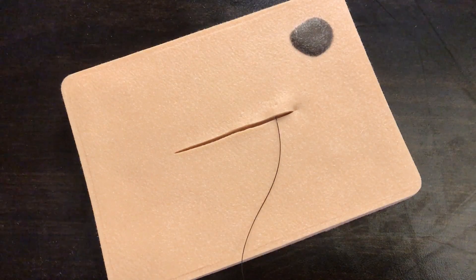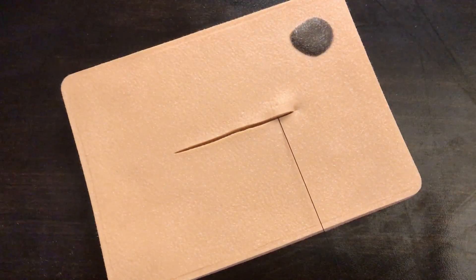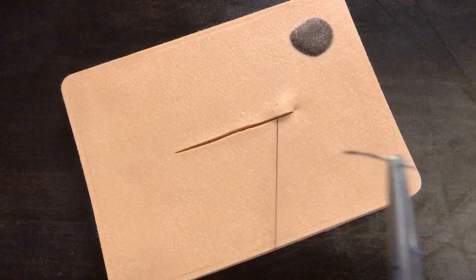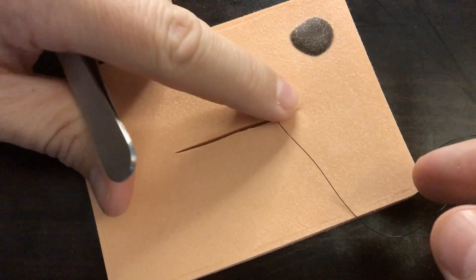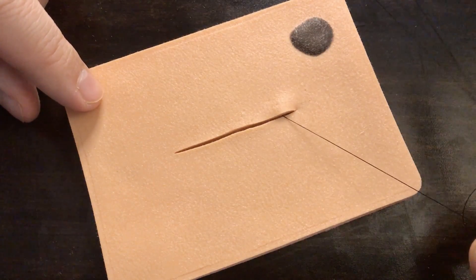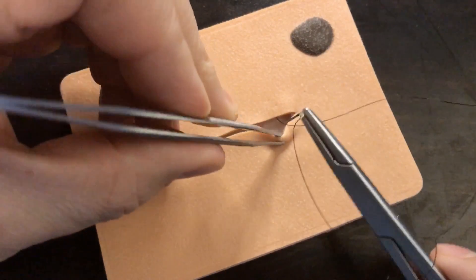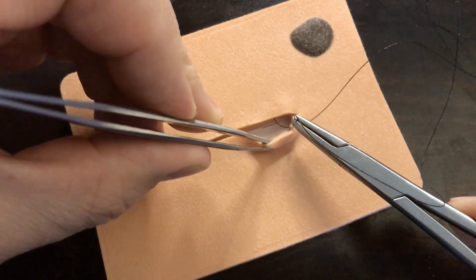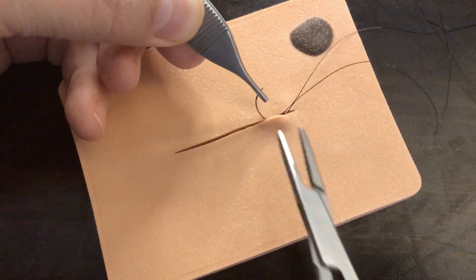So the next step then is I just need to go back the other direction. Now with subcuticular suturing, you want to at least go straight across, perpendicular, straight across, or maybe back just a touch. If you go forward, it's going to end up kind of crunching your incision this direction. So I'm going to go back just a little bit because I made a rather large pass with that first pass through the skin and that horizontal plane. So I'm going to go back just a touch and enter the skin there. So let me show you, I'm going to pull back on the skin now, and I want to be back a little bit behind where it was that I exited on the other side, passing through the tissue, and again making sure I don't buttonhole, and pull that through.